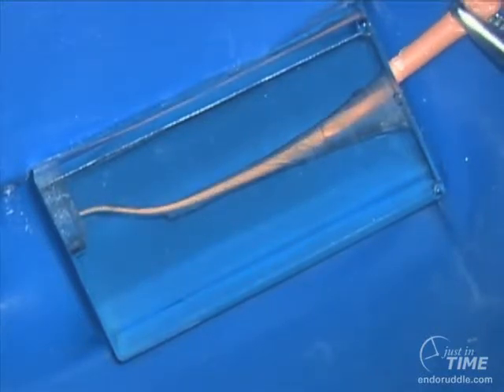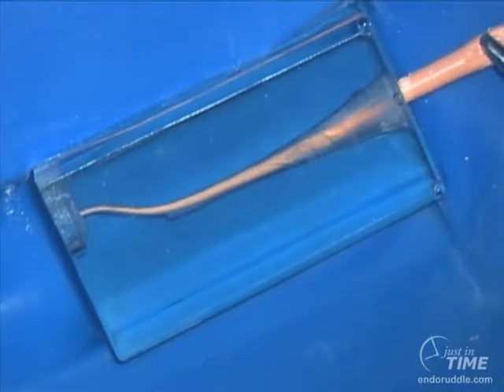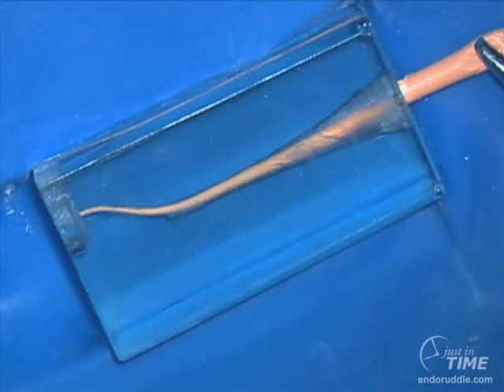A helpful hint is to dip the pre-curved cone in a dappen dish of 70% isopropyl alcohol. By dipping the cone in alcohol, you can make the tip of the cone much more rigid, which is a big advantage when sliding the cone through the coronal 2/3, and it will help you bypass the ledge without the cone rolling over and creating an upset.